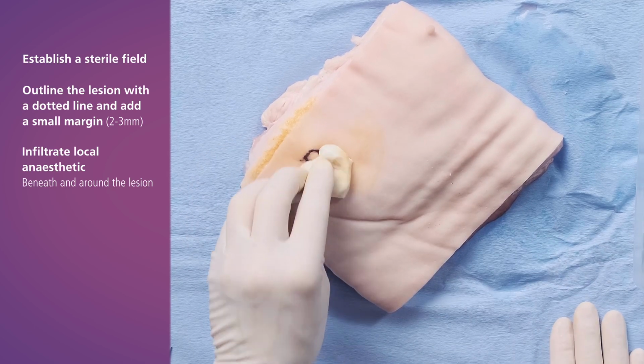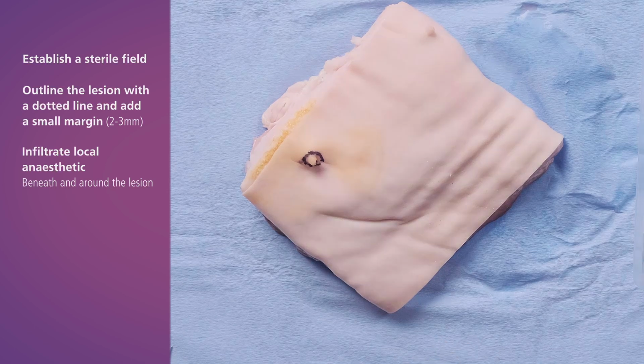There are several ways to approach a Curettage and Cautery by 3. I prefer to perform a small shave biopsy first and send that to histology, as it is easier for the pathologist to diagnose compared to sending tissue fragments gathered from a curette. Not all dermatologists will perform this step.